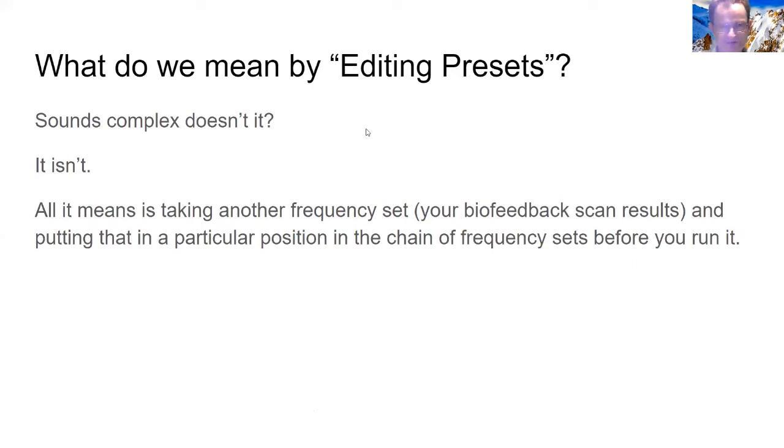Now we're going to talk about editing the presets themselves. This is relatively easy.